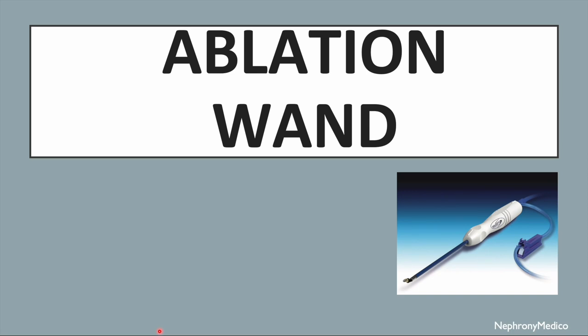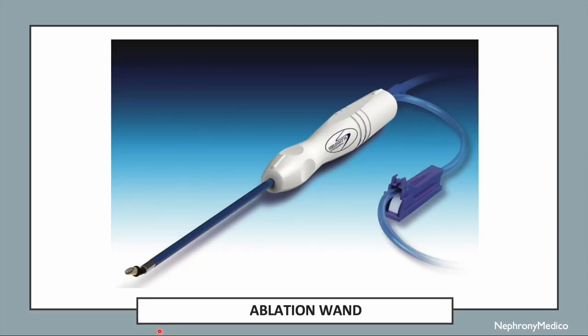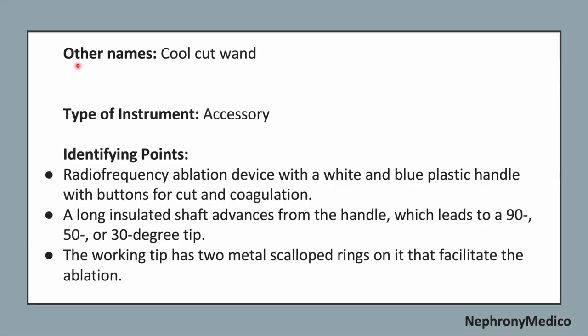Let's talk about ablation wand. This is a picture showing a modern type of ablation wand. Now other names: Coolcut wand, and this is an accessory type of instrument. Now identifying points. The radio frequency ablation device with a white and blue plastic handle with buttons for cut and coagulation.